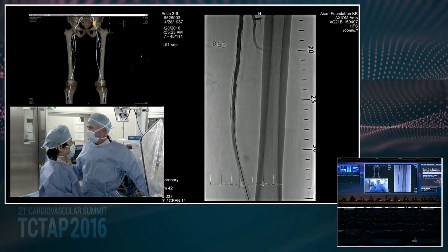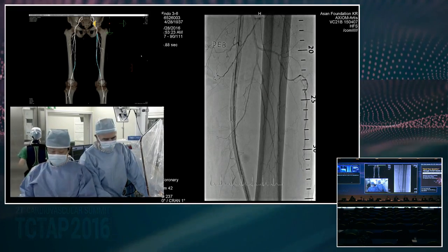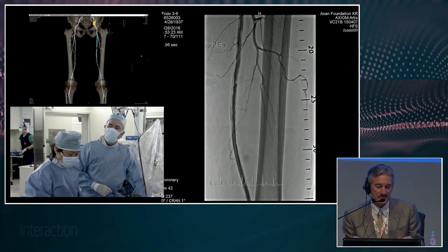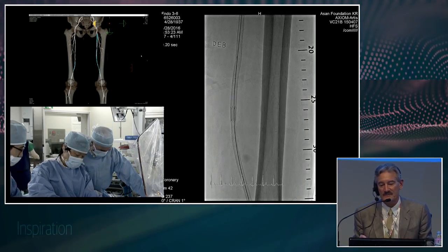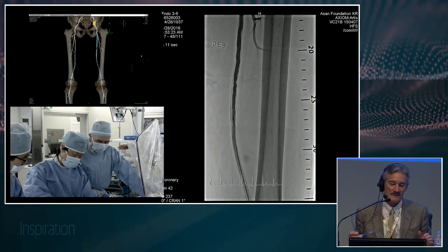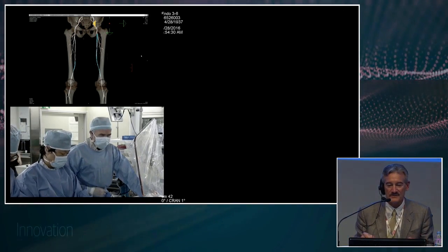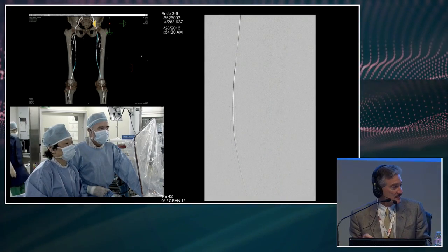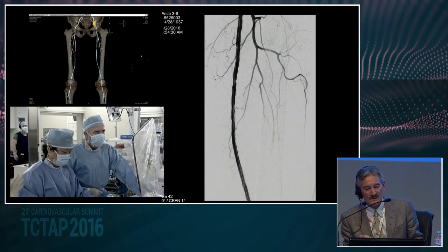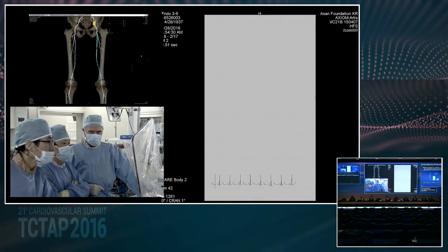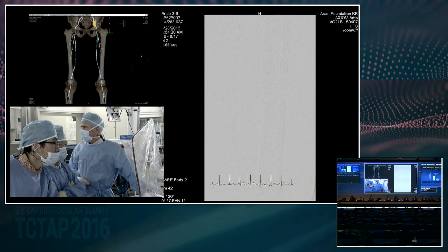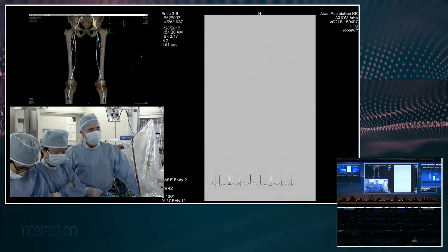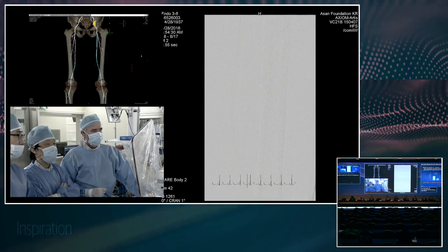There's a lot of interest in NOACs for management of patients undergoing vascular intervention. One strategy we haven't discussed is relining the ISR with a Viabahn. When do you decide to do DCB versus a Viabahn? This is a long stent column where Viabahn might be a good approach, but only part of the stent column is restenotic and it's easily managed with one, maybe two DCBs.